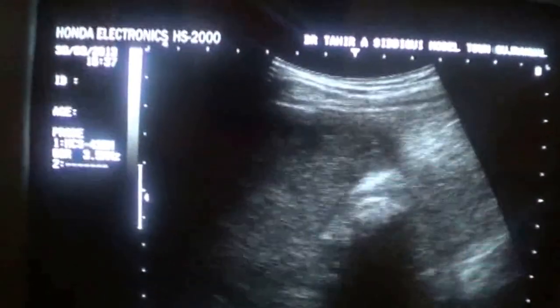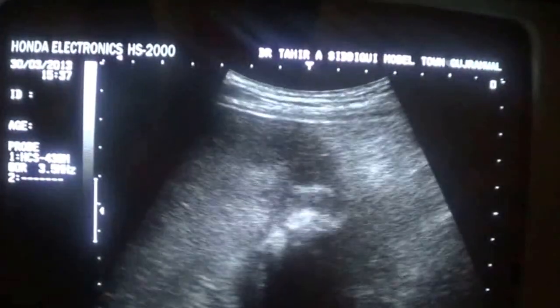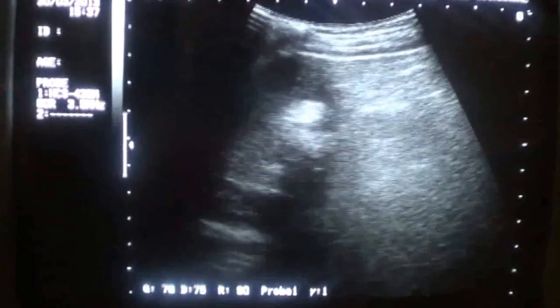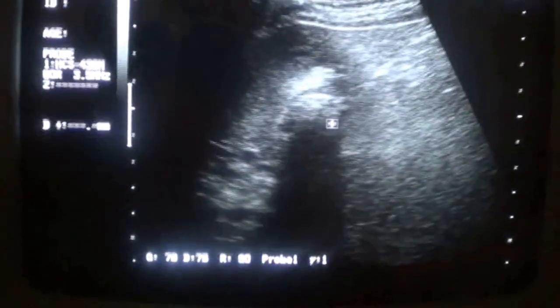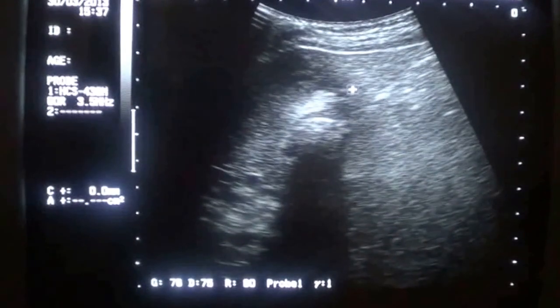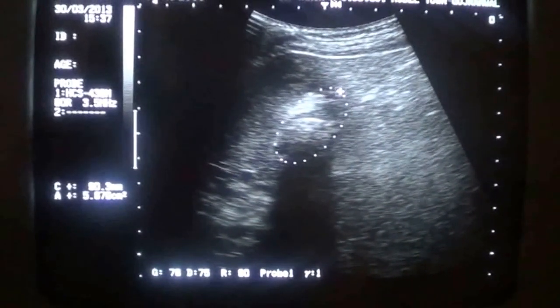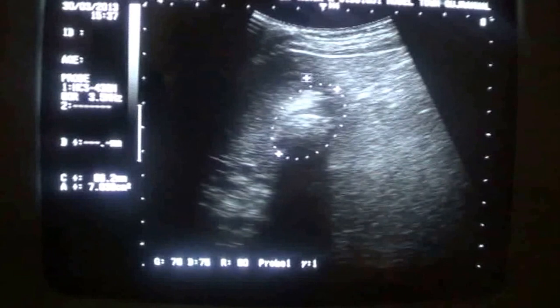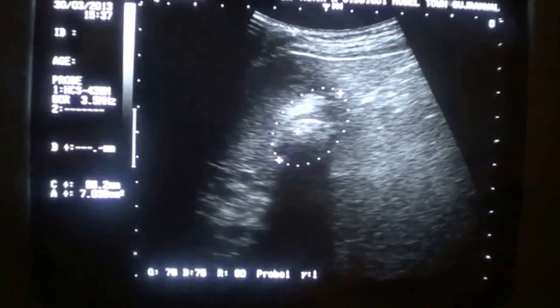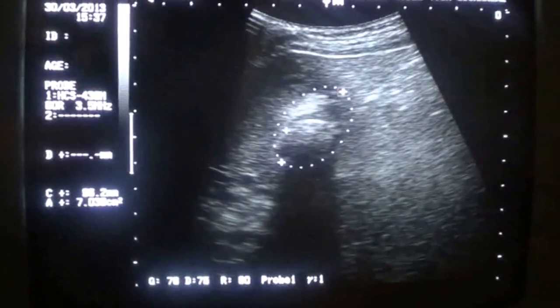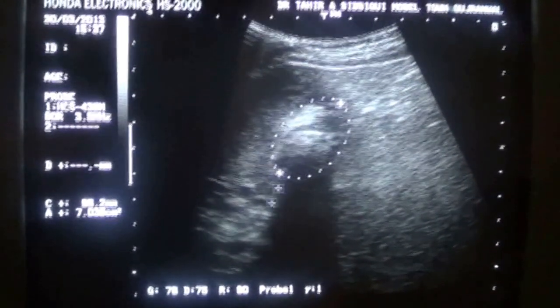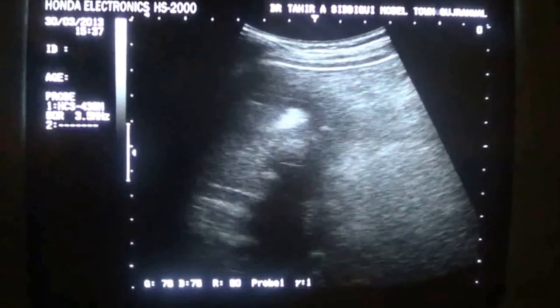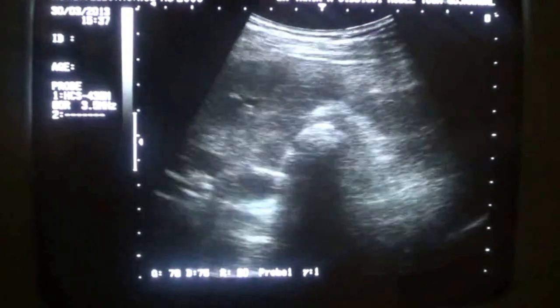This is the gallbladder, and the gallbladder shows muffled walls. If you see that the walls of the gallbladder are totally muffled, within it you can see echogenic areas. This big echogenic area is giving a sharp posterior shadow and is consistent with a calculus, making it easy to identify the gallbladder.